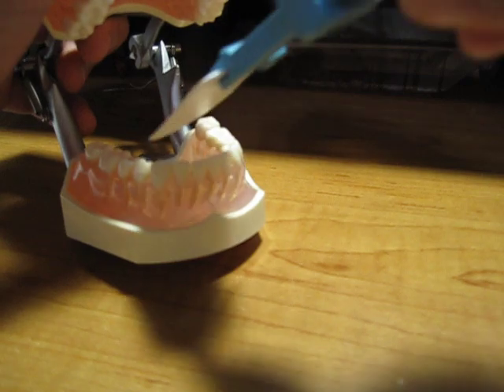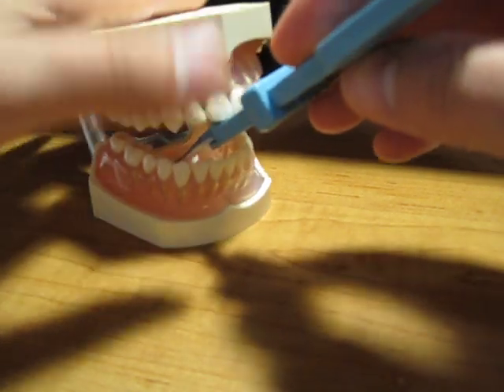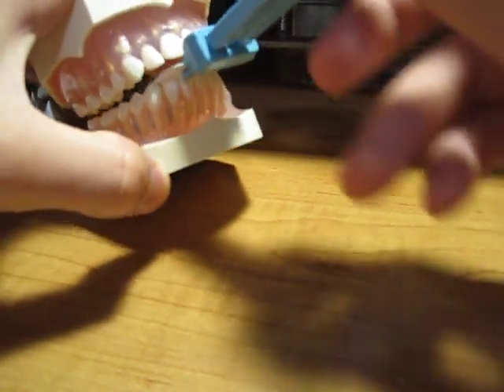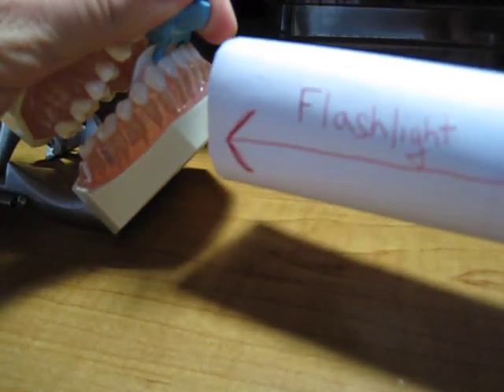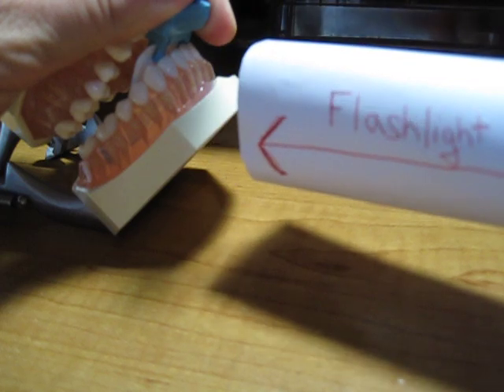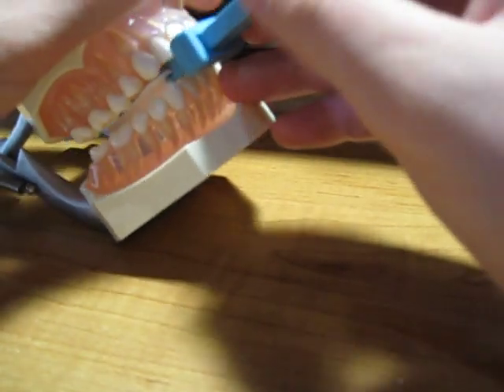For the lower teeth, you would just flip the snap array this way, and the x-ray beam would now come up from here. So you would shine a light right there, and so on.